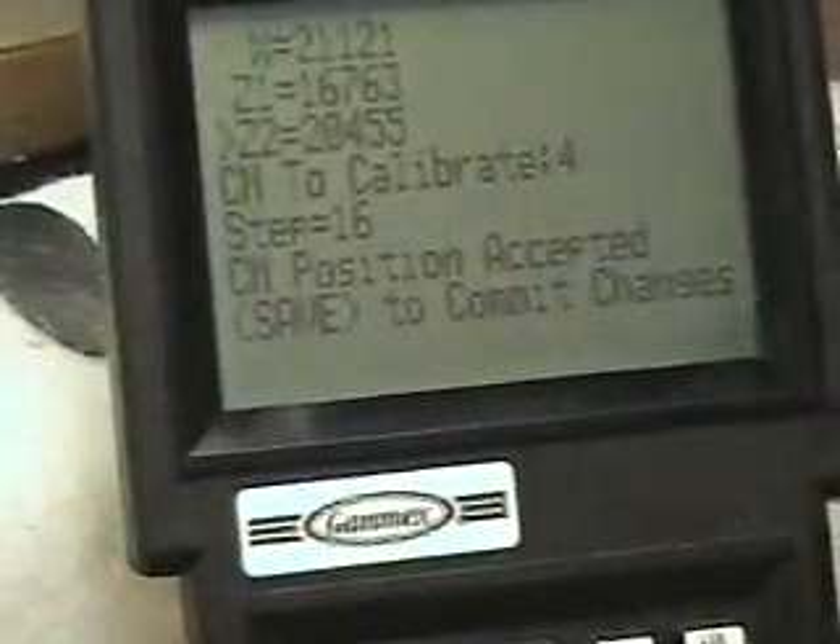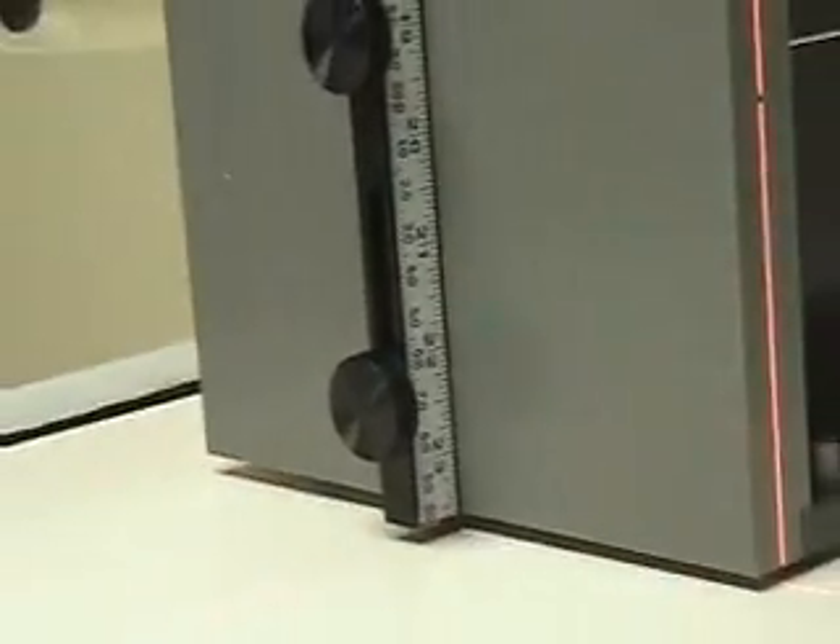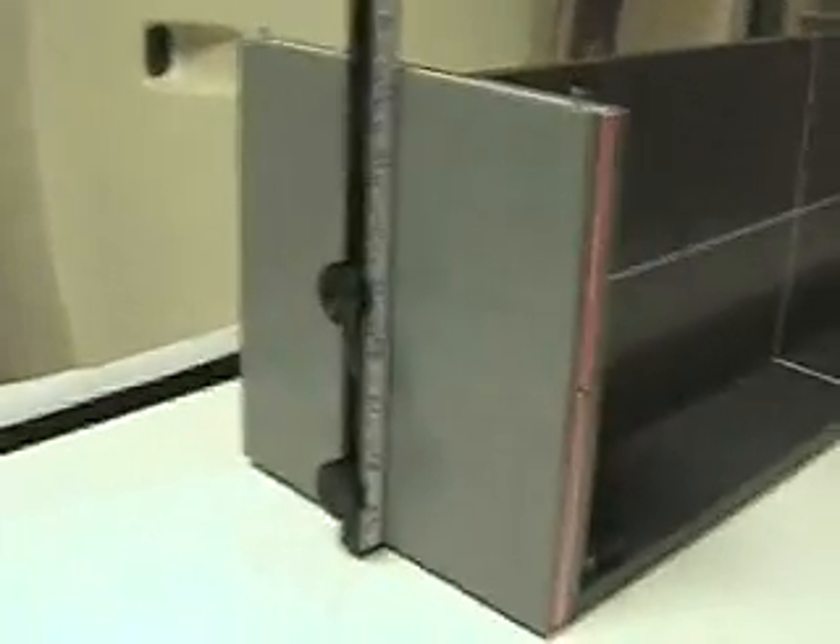And go on to centimeter number five. Then we're going to repeat this process from five, all the way up to positive thirty, which is this 200 point. We need to verify that it's moving each centimeter all the way up until that point. Once that's done, then we're pretty much done. All you have to do is go back to zero and hit the save button, and you are done at that point.